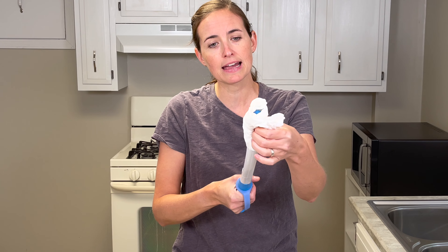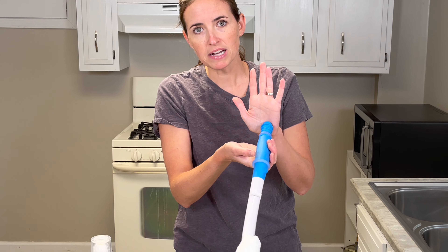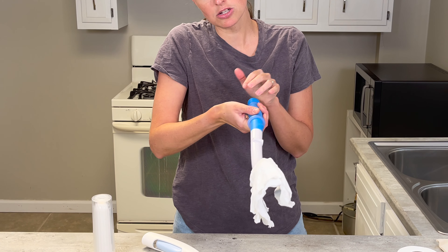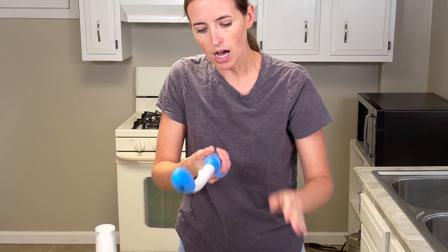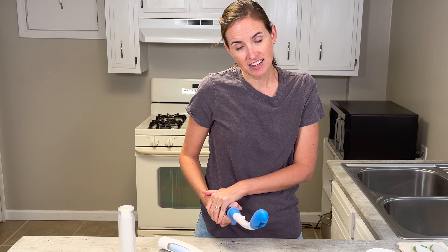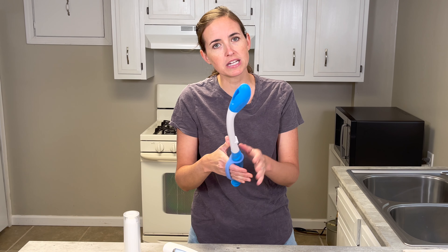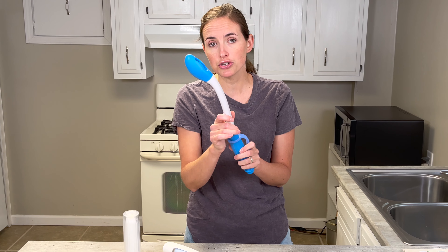To release this one — probably my least favorite feature, but it can work — there's a button on the bottom. Press it and it releases the toilet paper, which you can drop into the toilet or wastebasket. The button does take some force; you can press it against your thigh or hip if you don't want to press it against your hand. You do have to hold on pretty firmly, so this is probably the one that requires the most strength to use effectively.